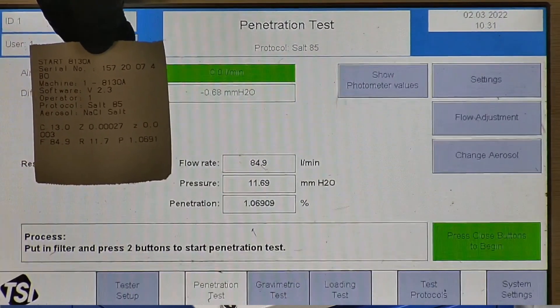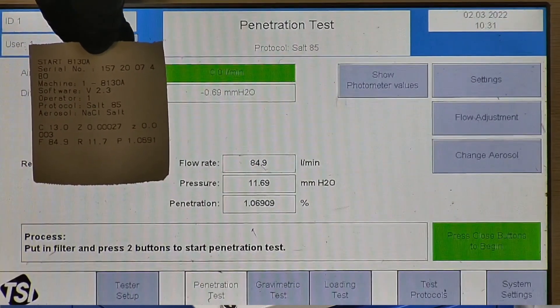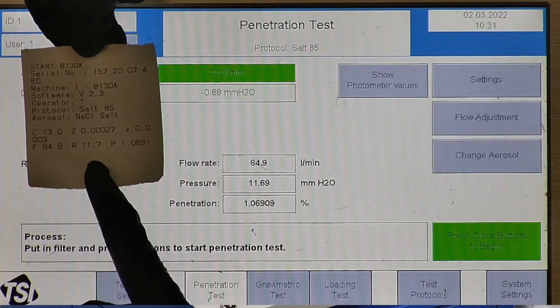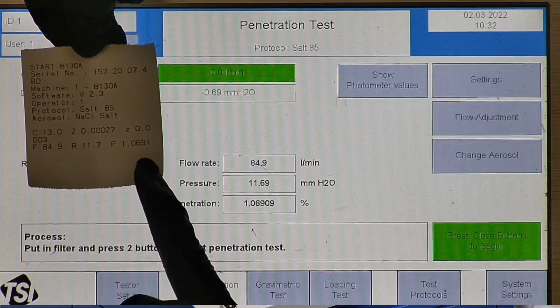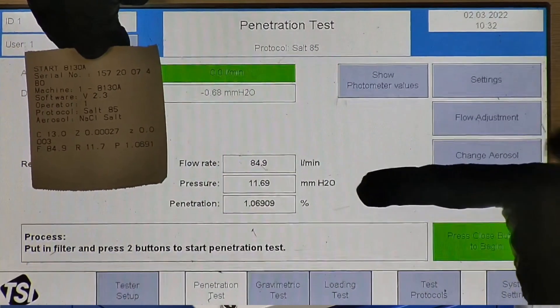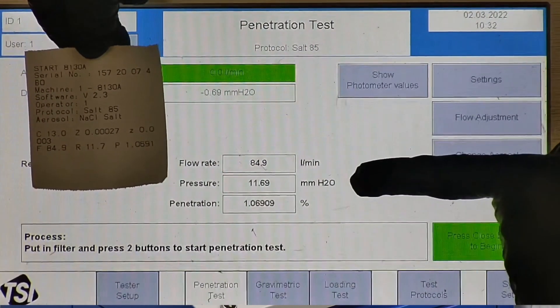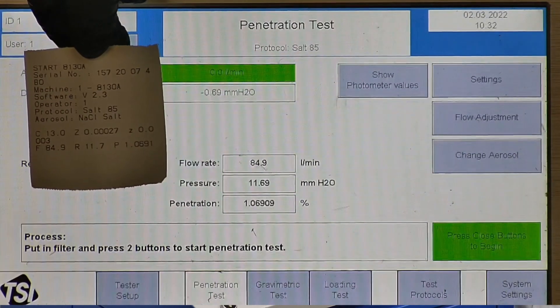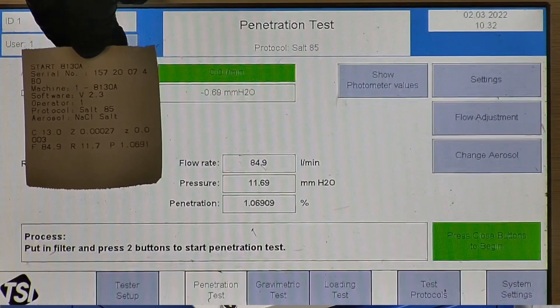R is for resistance, also referred to as pressure drop — this correlates with breathability, so the lower the number, the more comfortable and breathable the mask is. P stands for penetration percentage. The penetration percentage of this respirator is 1.07%, which is equivalent to 98.93% filtration efficiency.